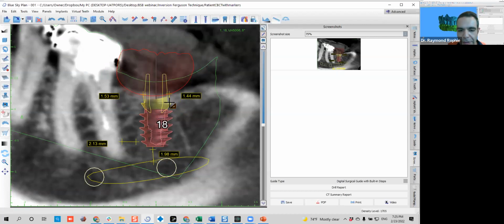Again, as I told you, this is the advanced way, or at least this is the way that I plan the cases for the Lab Pronto surgical guides that I do, and also for the patients when I go to lecture in courses, or I don't have patients anymore. I will definitely try to get it, but that's some point in time.